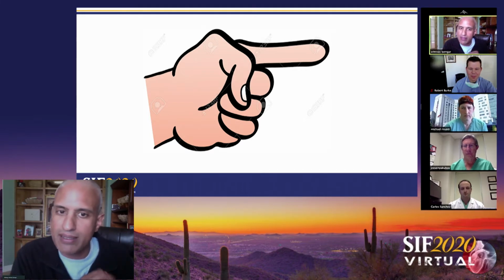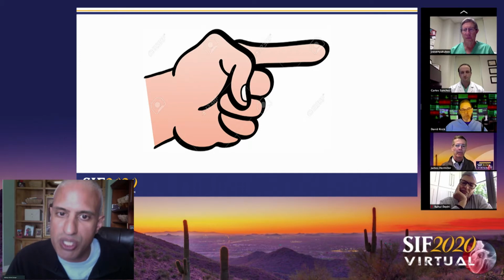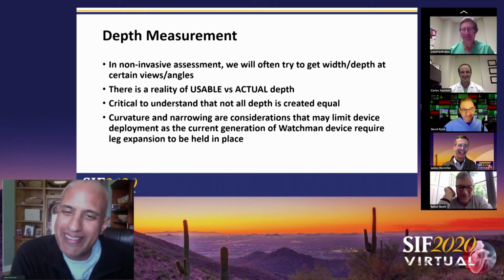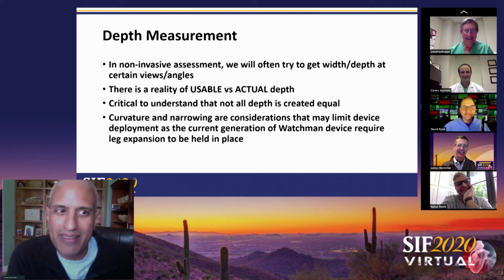So this is a type of lobe I can't really describe other than what I just showed you with the picture. But I think that exemplifies the difficulty in just using the depth by number on TE versus what you can actually see. Yeah, I actually think it's shaped more with a middle finger on this one. Yeah, that's kind of what I felt like after we did this, after seeing that. So I felt that I was a little bit against the grain on that one at that point.